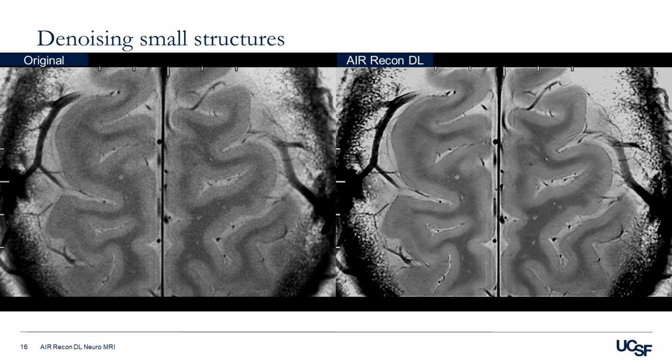And keep in mind, I'll use this time to pause for 1 second and remind everyone of what was discussed earlier, which is there is very much a tunable factor for signal to noise ratio improvement. And as you deploy this tool in the clinic, it's maybe something where you dial in to a particular preference for your group.